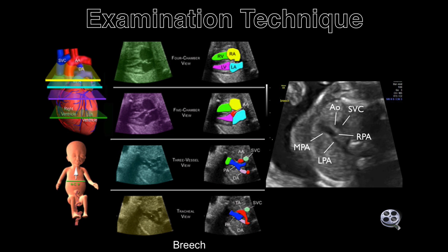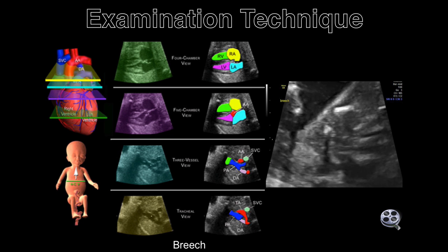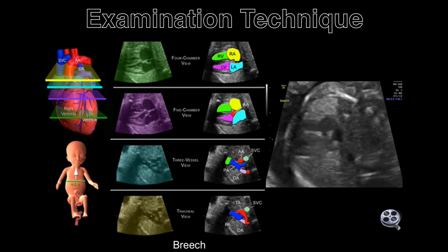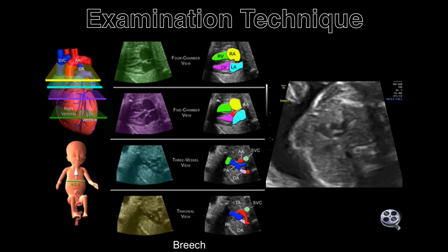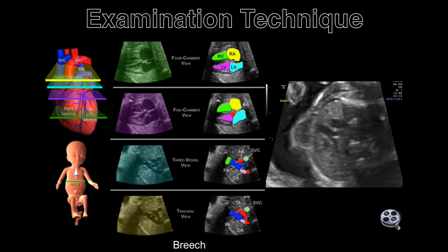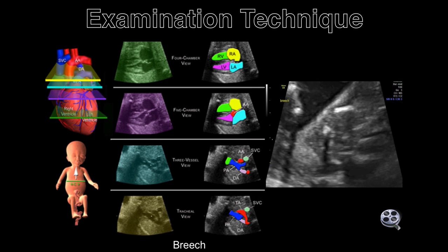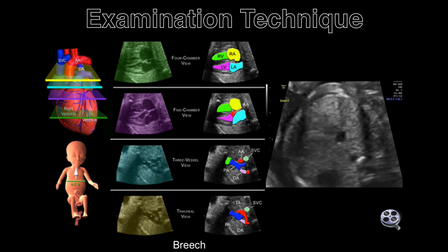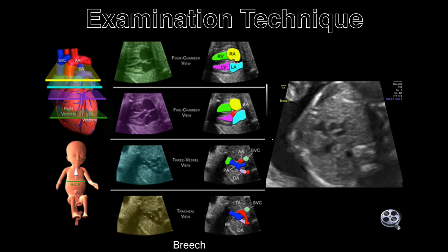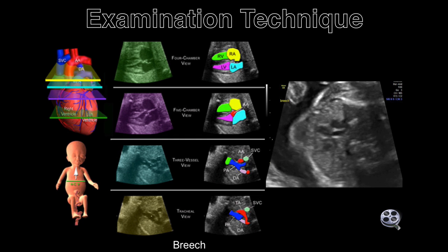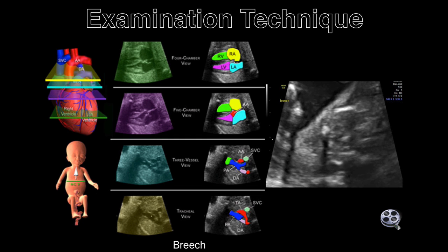3. The three-vessel view. Cephalad to the five-chamber view is the three-vessel view. This view contains the main pulmonary artery originating from the right ventricle, continuing on as the ductus arteriosus as it enters the thoracic aorta. Perpendicular to the main pulmonary artery is the cross-section of the ascending aorta and the superior vena cava. Because this view demonstrates the main pulmonary artery perpendicular to the ascending aorta, the criteria are met to exclude transposition of the great arteries.